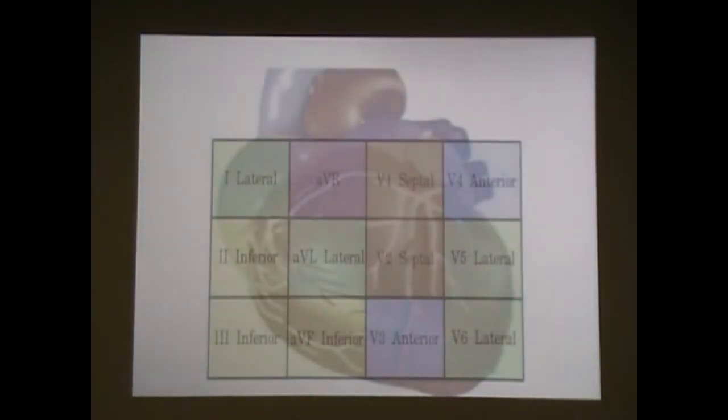When I'm teaching new nurses in the ER or someplace, when people are looking at an EKG, they have a hard time a lot of times correlating to where that is going in the heart. If you have a full-size 8x11 piece of paper EKG, which I know you guys don't, you hold it up to your chest, you put the left side up to the right side of your heart and wrap it around, guess what? That is showing you exactly where the infarct is happening, or the injury pattern.